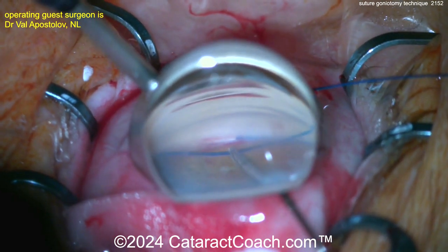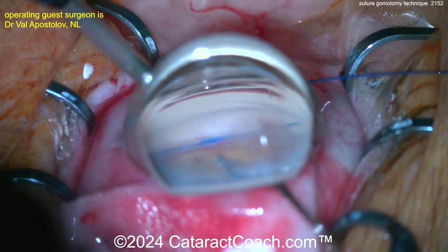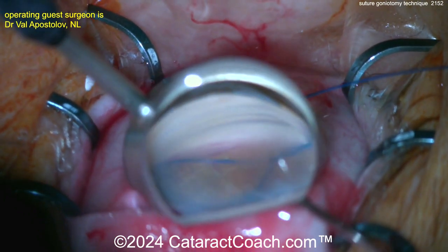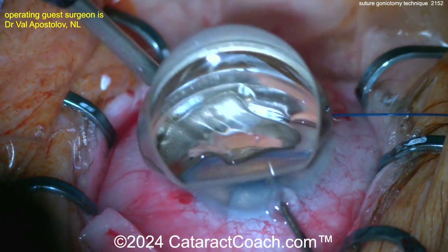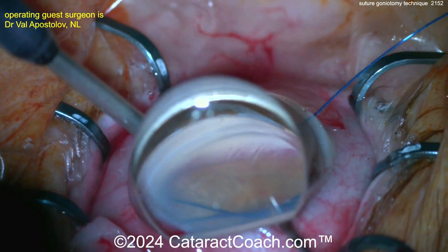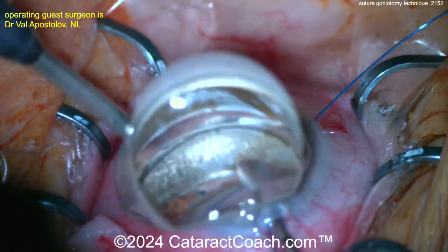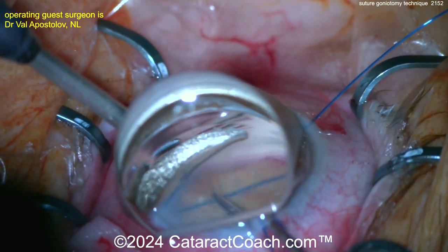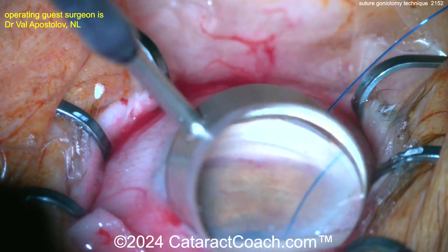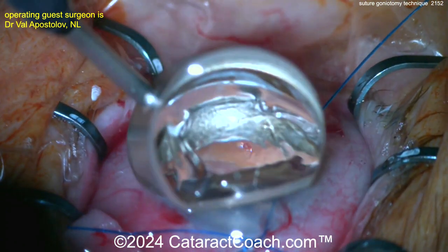We can advance it more and more, and as it comes around you'll see the other end — there it is! It made a full 360 degrees. What started as a small opening in the trabecular meshwork is now a very large one. Now you can grab both suture ends and pull, opening up the angle to perform the goniotomy. You'll even have a strip of tissue pulled off. Pulling those suture ends through creates your full goniotomy.